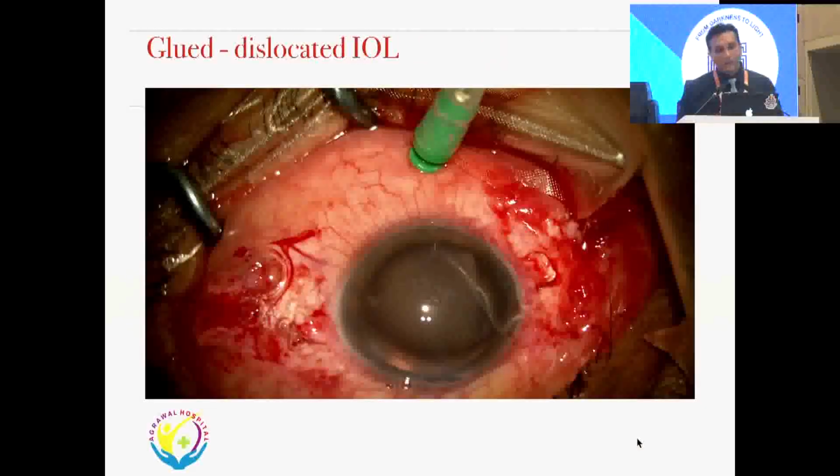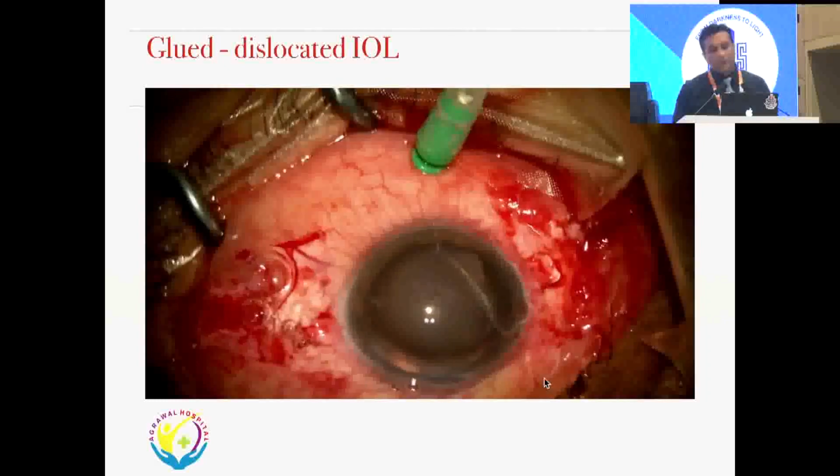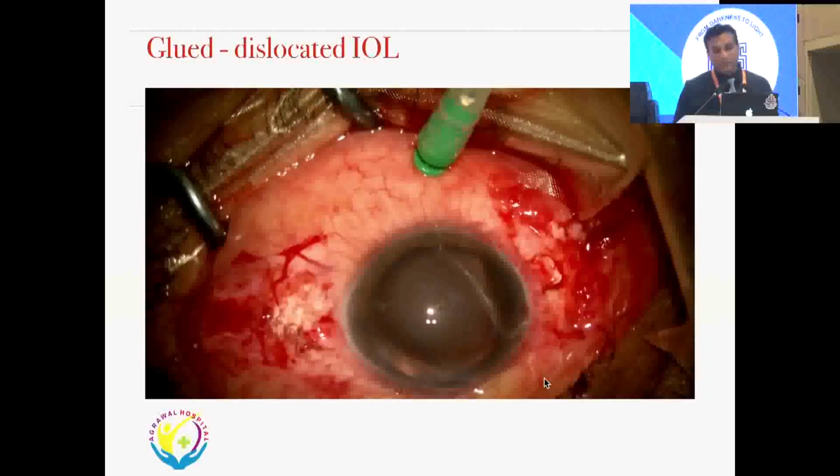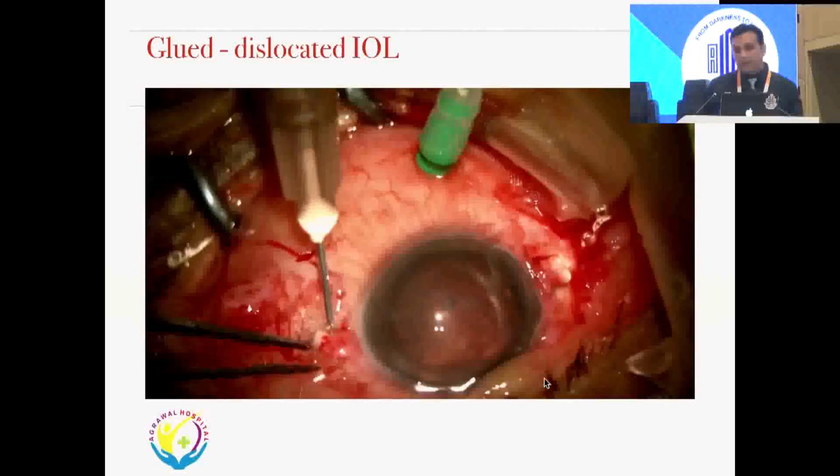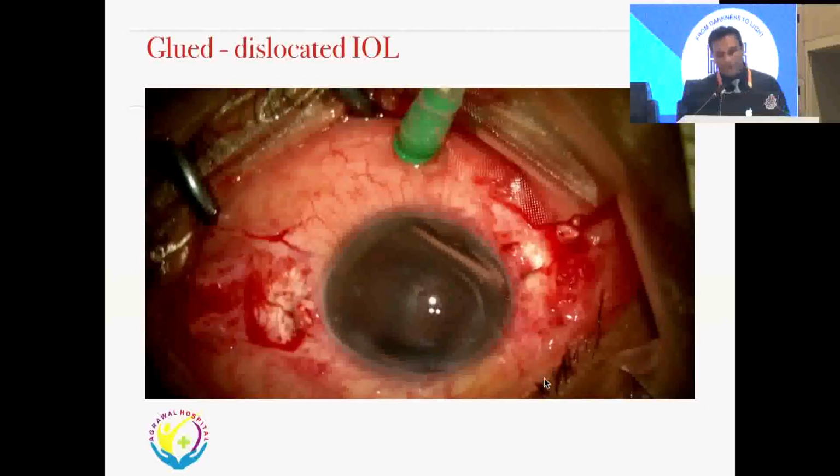Coming to the glued IOL, this video I have included because this is one of my first videos from around 10 years back, and this is what not to do. This is for the youngsters and the juniors here. When you start doing these types of maneuvers, you have to be wary of these things.